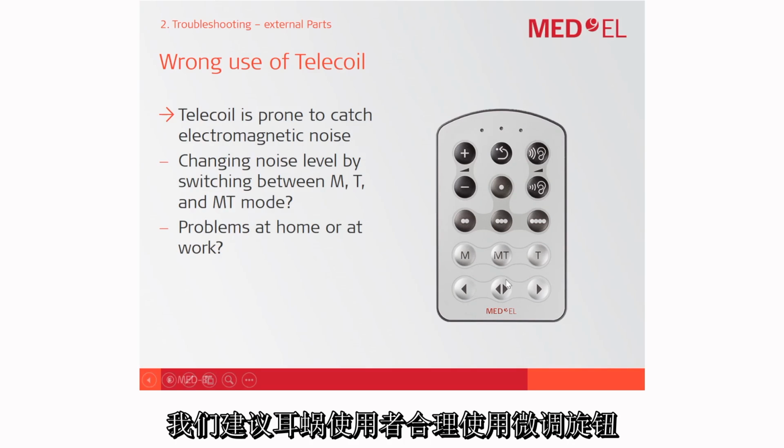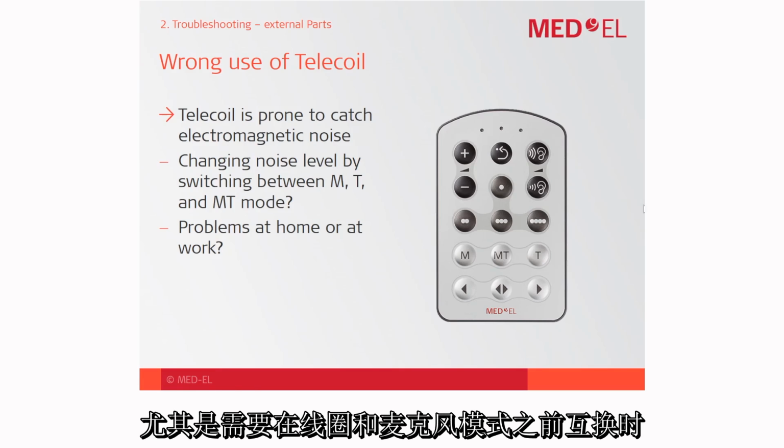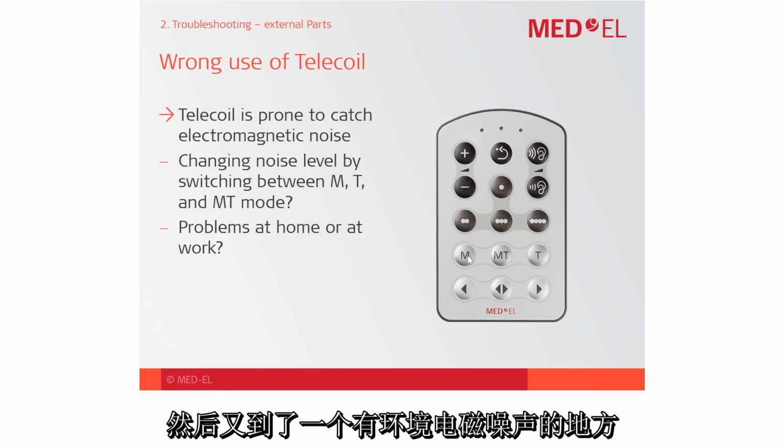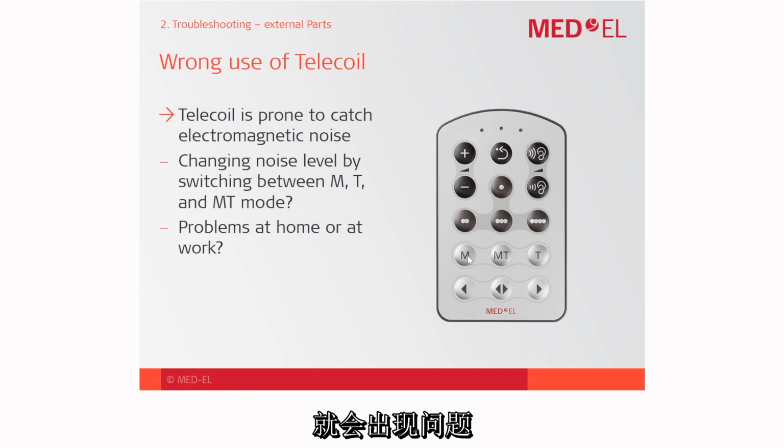So we always advise our patients to use the fine tuner, especially when they want to change between the telecoil and the microphone mode. However, this could lead to problems if they don't switch back to the microphone mode and then go to a different location where electromagnetic background noise is present.